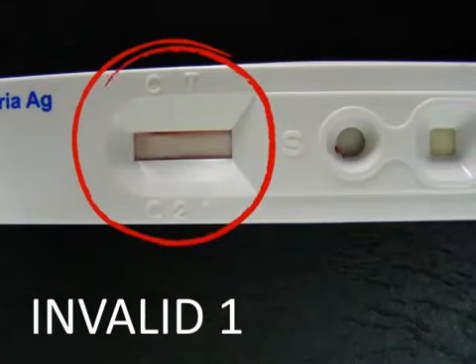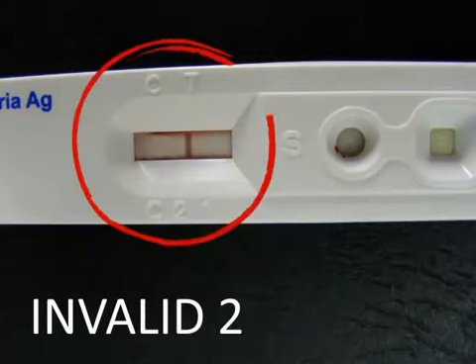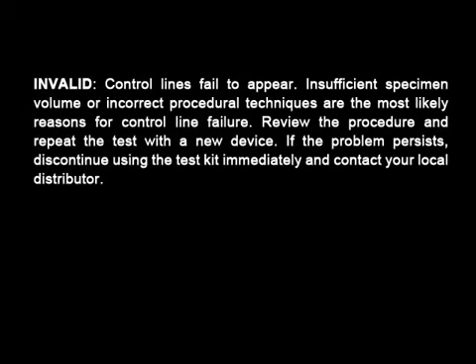For a result to be invalid, a control line fails to appear. Insufficient specimen volume or incorrect procedural techniques are the most likely reasons for control line failure. When this occurs, review the procedure and repeat the test with a new test device. If the problem persists, discontinue using the test kit immediately and contact your local distributor.